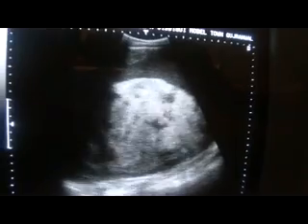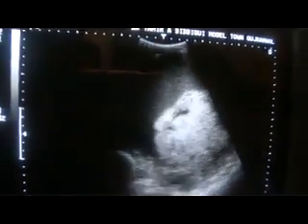It elevates the IVC, and the aorta is seen posterior to it, with the spleen displaced superiorolaterally by the pressure of this mass. Left kidney is not seen, and the mass is well demarcated. It's a huge mass. We cannot see it or measure it in one plane.